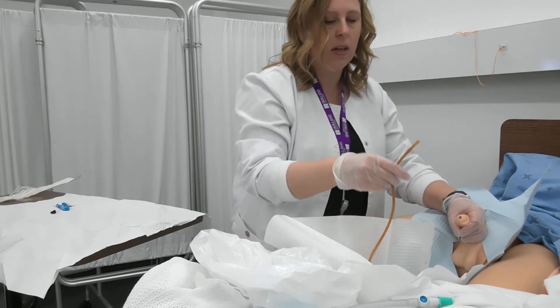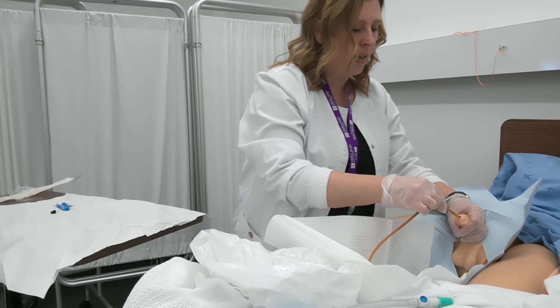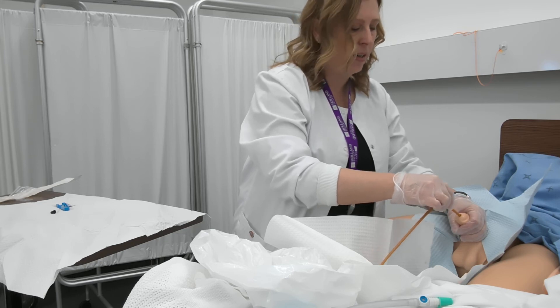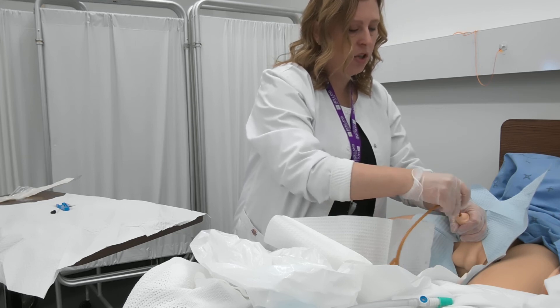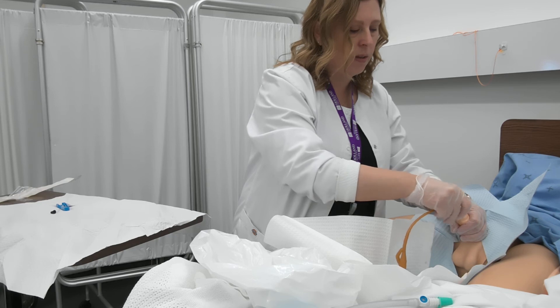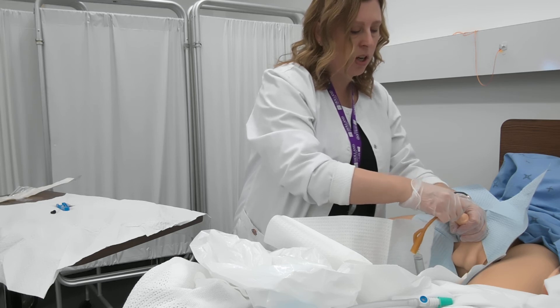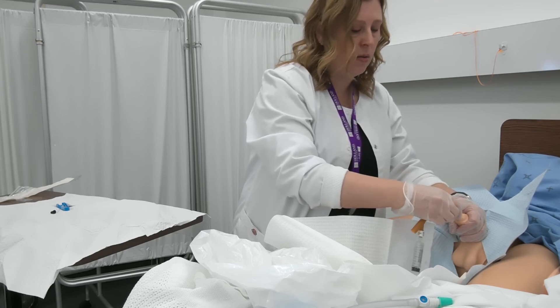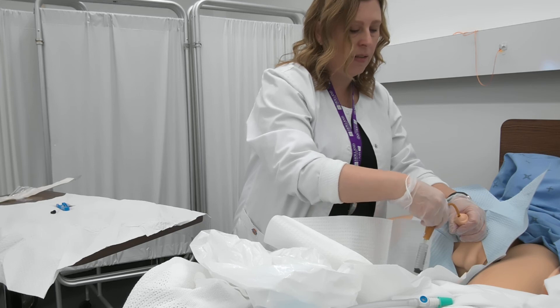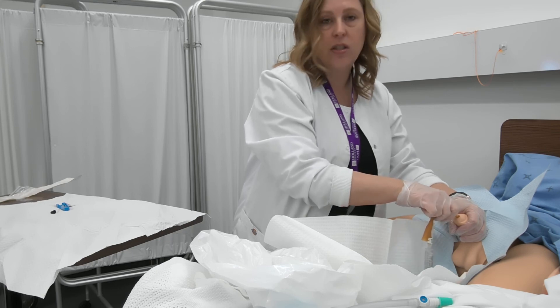When we're ready to insert, we're going to get our client to take a deep breath in and then exhale. On exhale, we're going to go ahead and put the catheter in. You want to hold the penis at about a 90-degree angle. For some gentlemen, especially if they've got issues with the prostate, you may find it's a little difficult to get past that obstruction. You may have to insert right up to the bifurcation — basically where the end of the catheter meets the port to inflate the balloon — before you actually start to see urine.